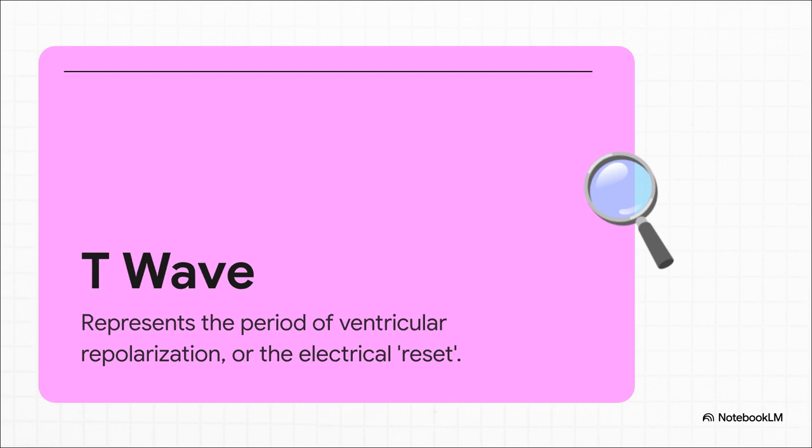This represents the electrical reset or repolarization of the ventricles. It's basically them getting ready for the very next heartbeat. And that completes the electrical story of one single cardiac cycle.